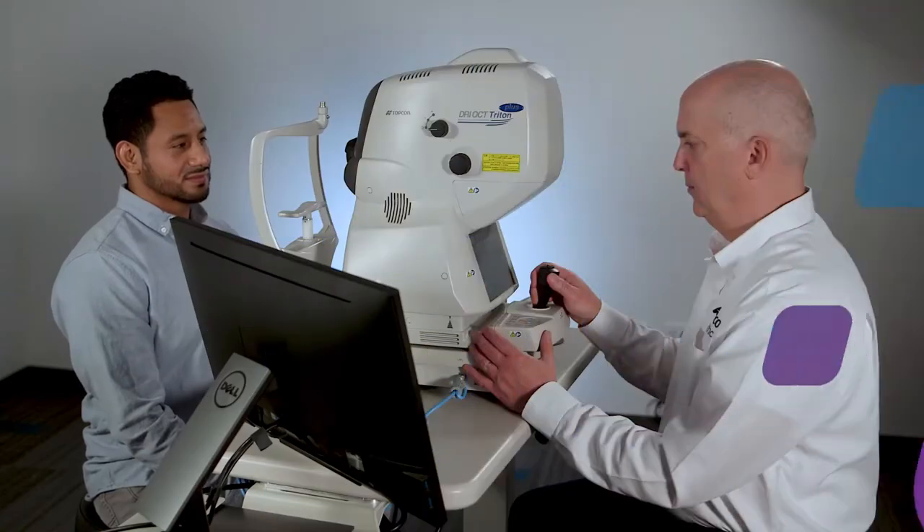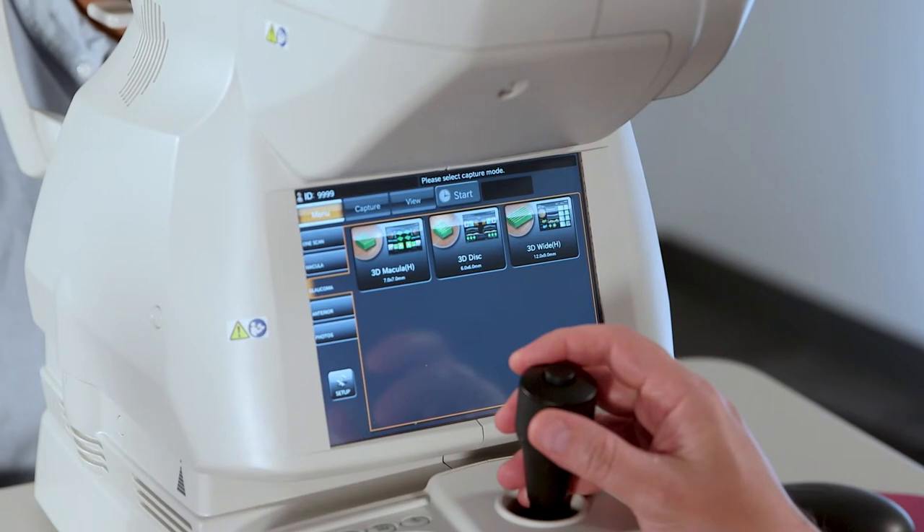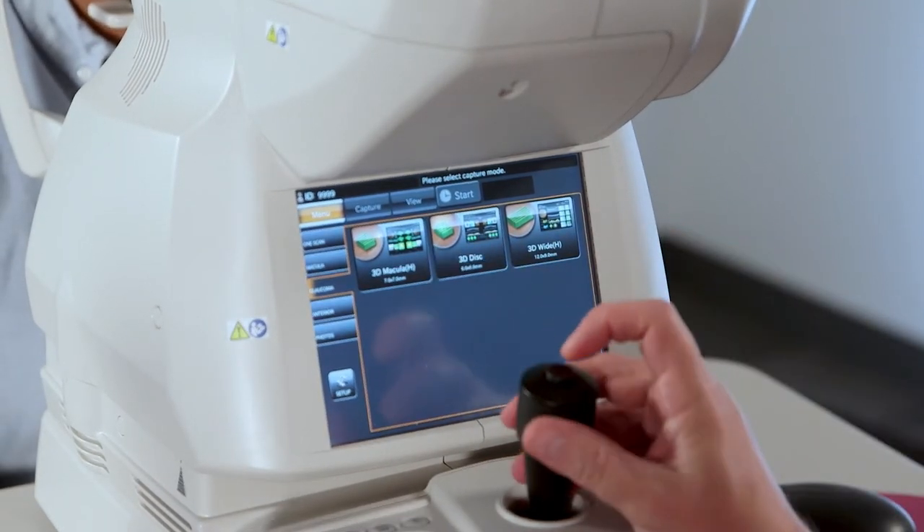Once we register the patient into Triton, we select the acquisition mode and choose the scan type. Let's choose the 3D disc scan — select the 3D disc icon on the Triton touch screen.